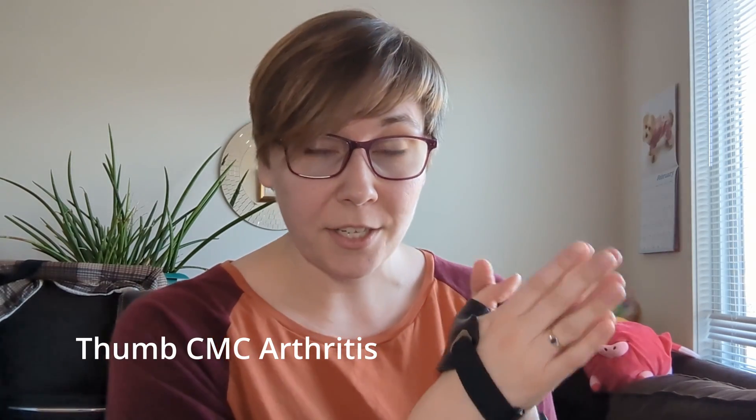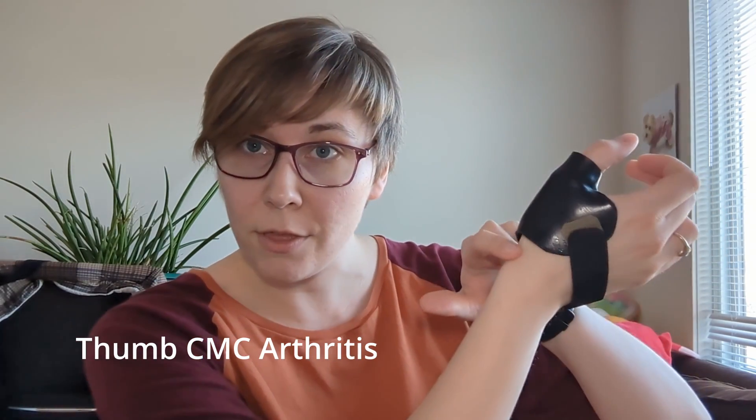Now for CMC arthritis. The CMC is the joint at the base of the thumb. Let's think about the purpose of a splint for CMC arthritis. Unlike De Quervain's and skier's or gamekeeper's thumb, arthritis is not typically a condition we expect to heal. It's a degenerative change of the joint surfaces, and no amount of immobilization is going to magically make those surfaces go smooth again. So we're not looking to cure the condition — what we are looking to do is decrease pain and increase function. Because of that, we actually have quite a lot of options for CMC arthritis, depending on what the patient's needs are.